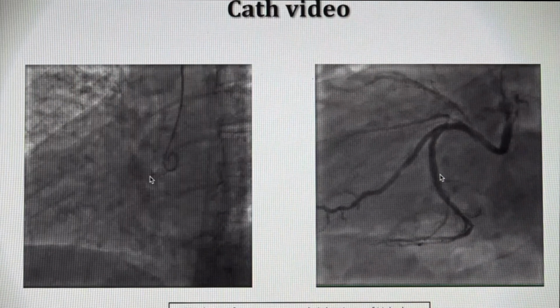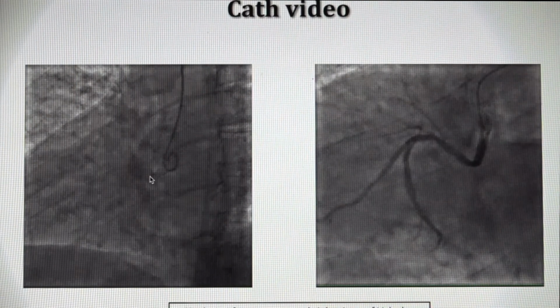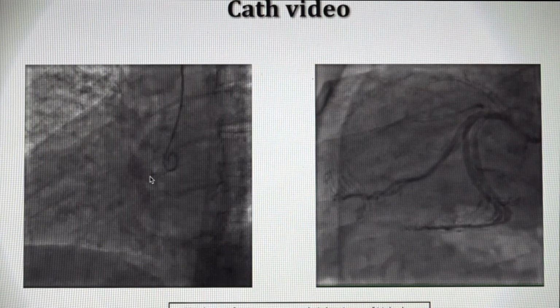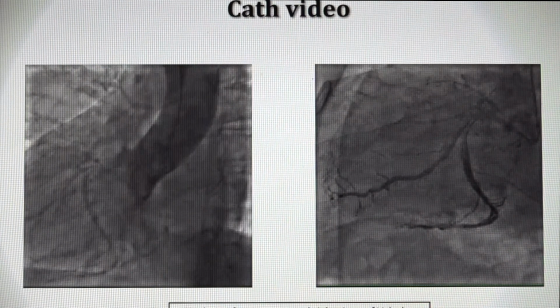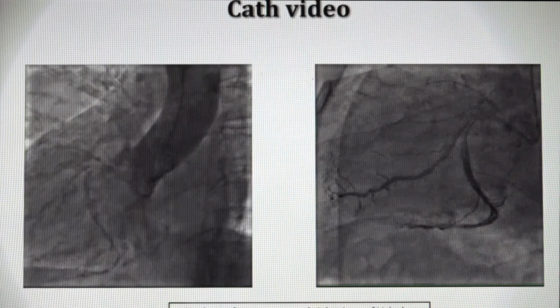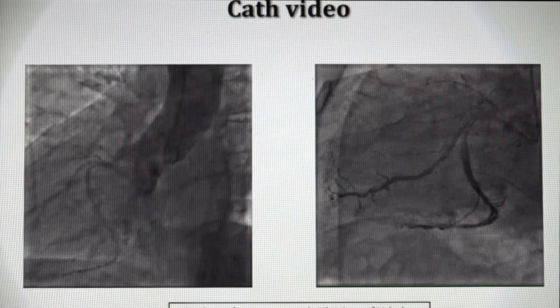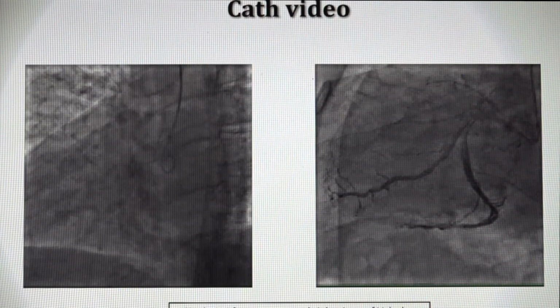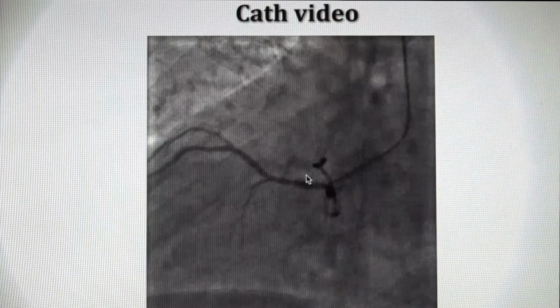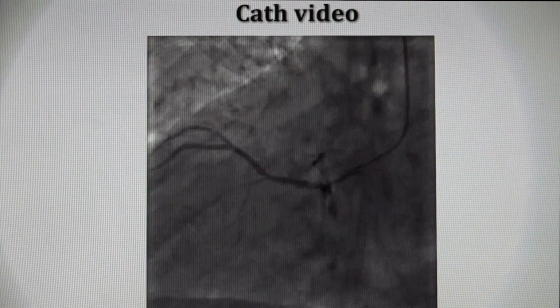The patient was then transferred to the cath lab, and when we did the catheterization, we noticed that the patient has one single coronary artery that trifurcates into the left anterior descending artery, the circumflex, and the right coronary artery. In the second shot, the aortogram, we confirmed that there is a trileaflet aortic valve. Another image of the coronaries shows basically a single coronary.